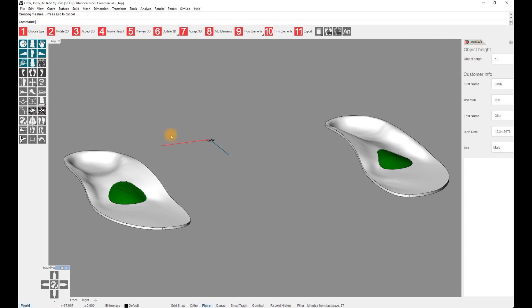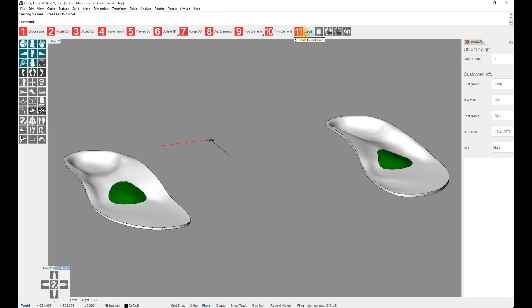If needed, the elements can be trimmed at the edges of the pattern with step 10, Trim Elements, and exported with step 11, Export.